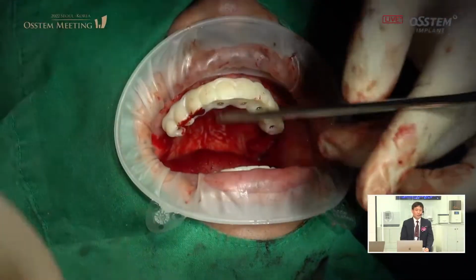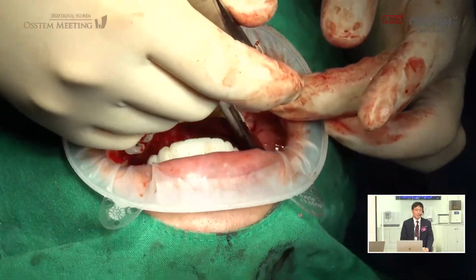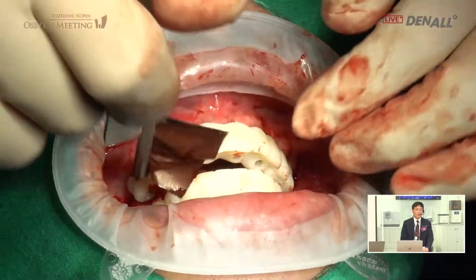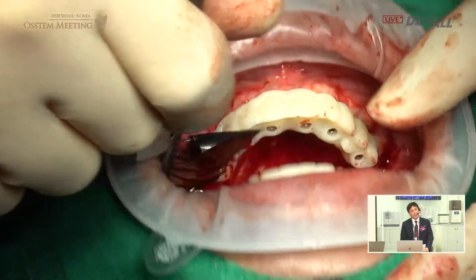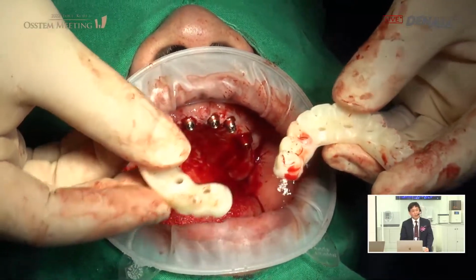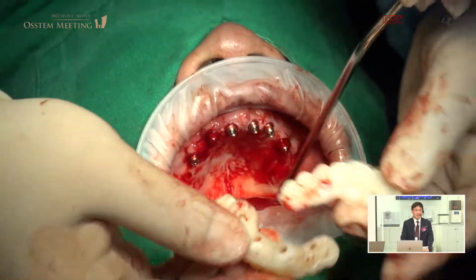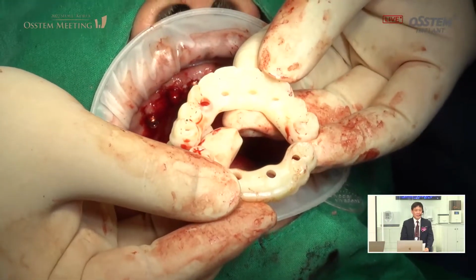So everything goes as planned, and I want to check it again. Can you close the mouth? Bite is okay. Articulation paper. Dr. Chung, are you satisfied? So the occlusal contacts, not bad.